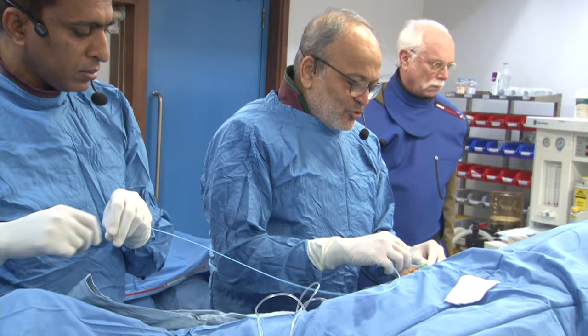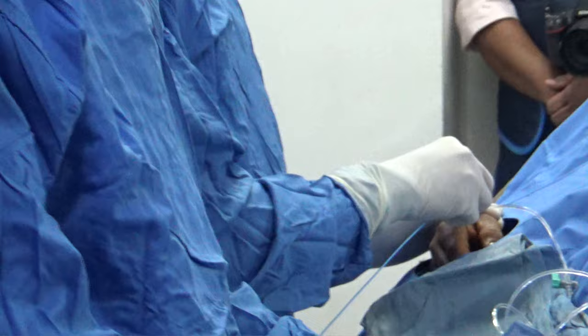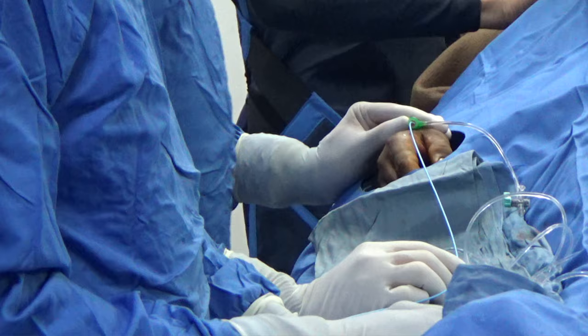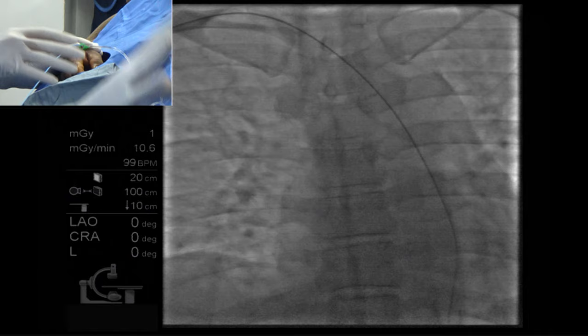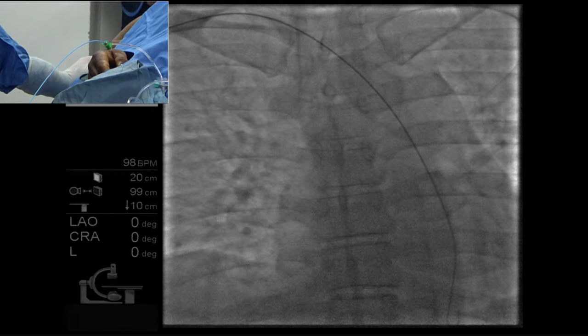Arteria lusoria to enter the ascending aorta. What are the things you guys are doing, and how many of them are you facing? It's not as infrequent as we at one point thought, and we are using the techniques that you have taught us, and they work much better than we previously expected.